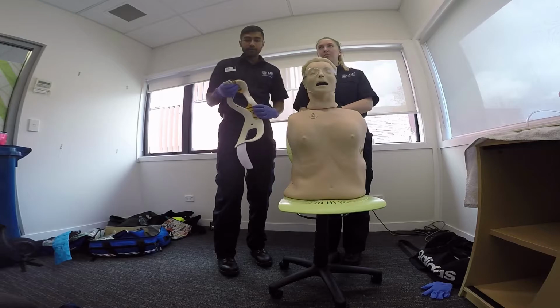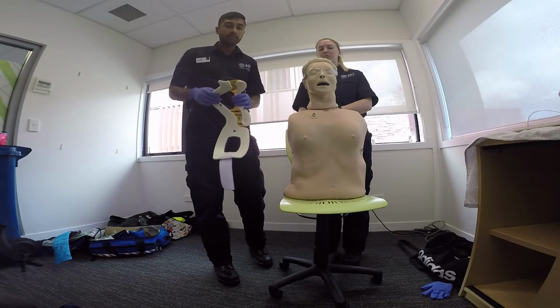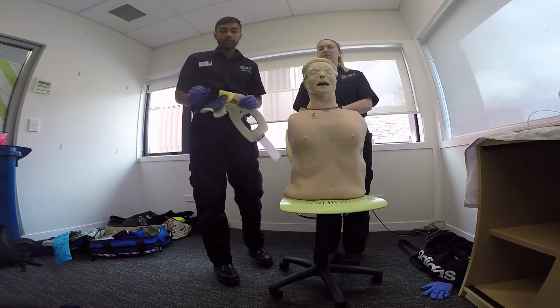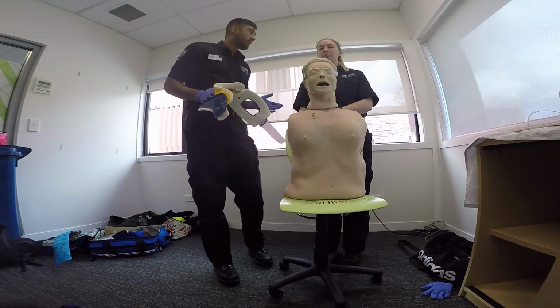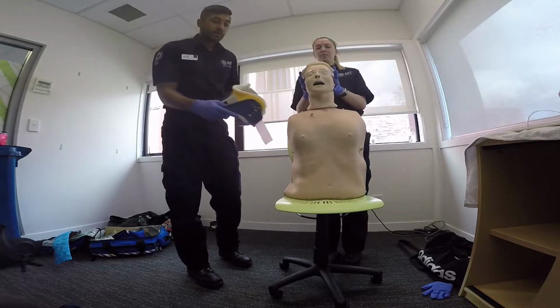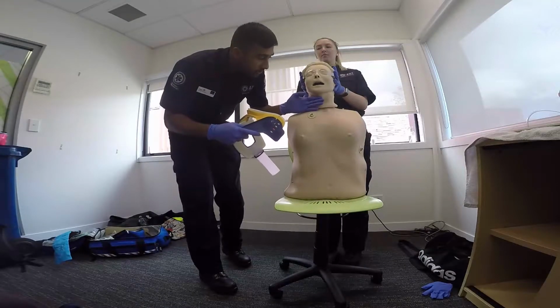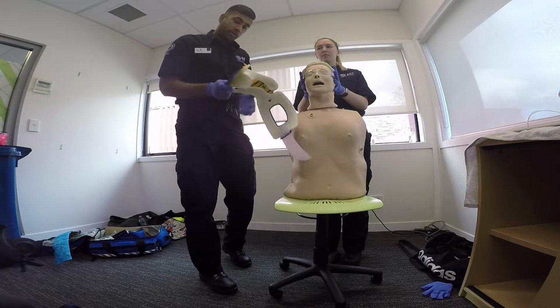or distracting injuries. Before applying a cervical collar, you want to explain the procedure to the patient as well as gaining the patient's consent. You also need a second person to help stabilize the head. So Shawnee, if you could help us put the patient's head into neutral alignment. To measure a collar, you want to start from the clavicle to the base of the chin. So from what I can see, that would be about short.